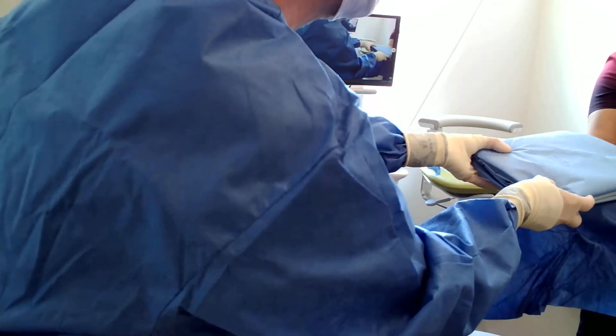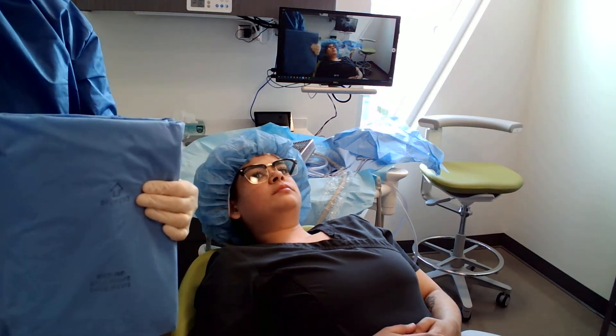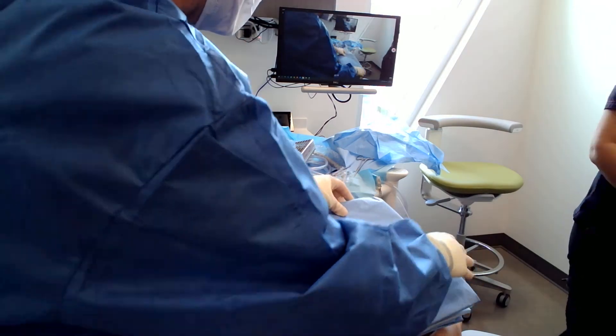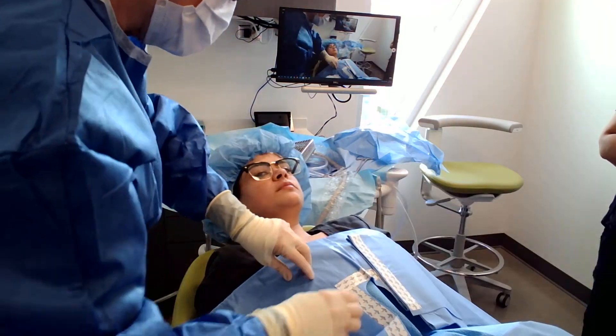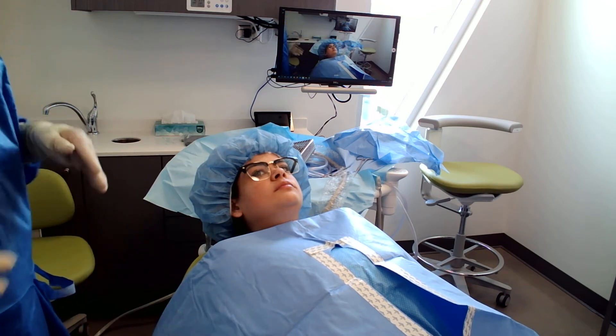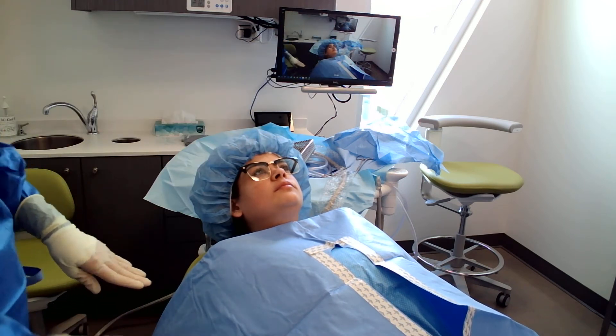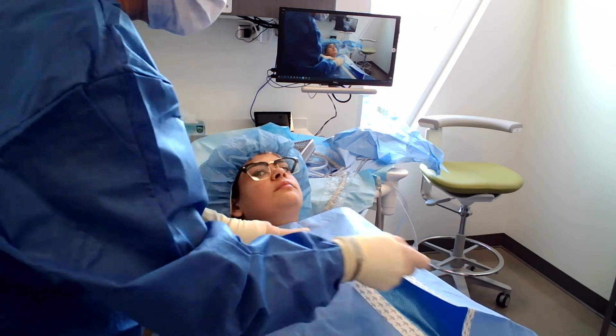There's a little arrow on here that says 'split end.' We want the split facing up. So I lay this on top of Courtney and start unfolding it. Sometimes you have help with this, but not always — and because Nina's not sterile, she can't help me. If something falls below the base of the chair, it's considered not sterile. Once we're good, I take all the tape off and pass it off because we want the operatory to look neat and tidy.